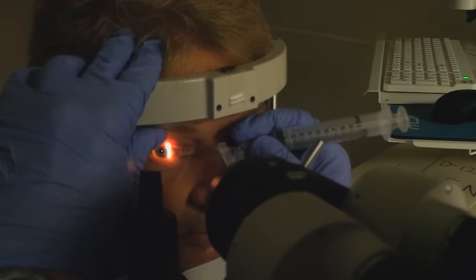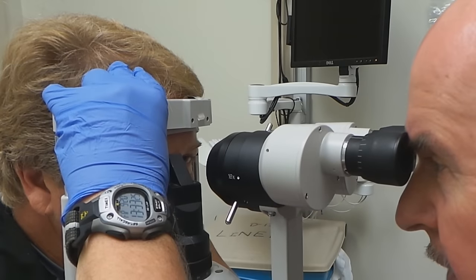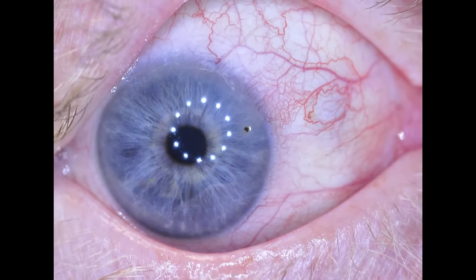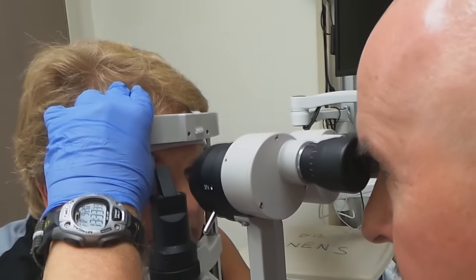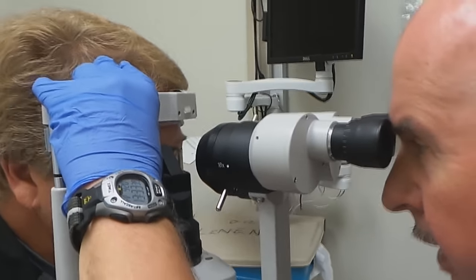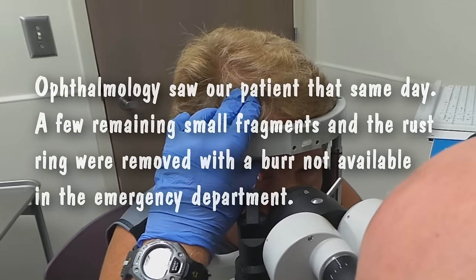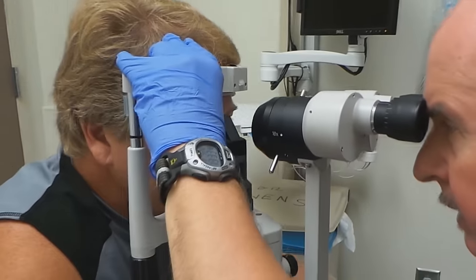There, I got it. I'm going to turn the light on for a minute. There's persistent rust in there. I see a little divot now where it was sitting but we flicked it off. I think I got it. You're going to have to be put on some medications, some antibiotics. And then I'm going to have you see the ophthalmology doctors tomorrow — oftentimes the very next day the rust ring will come out easier.